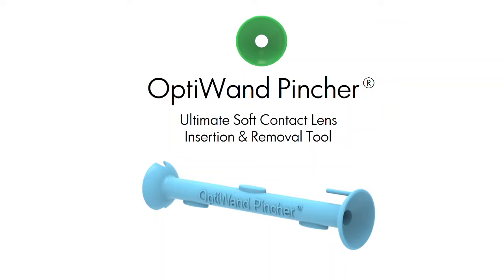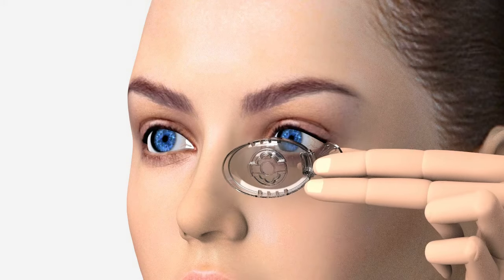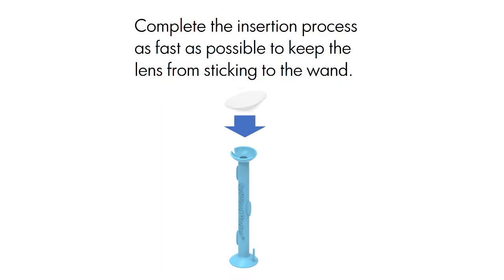Introducing the OptiWand Pincher. Apply eye drops prior to insertion and removal for lubrication. Complete the insertion process as fast as possible to keep the lens from sticking to the wand.